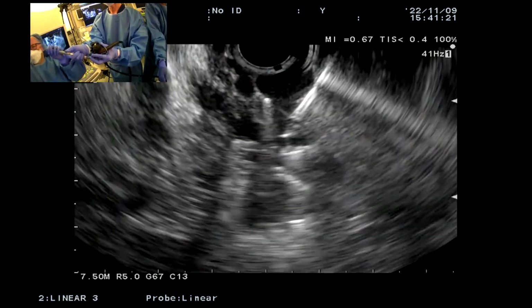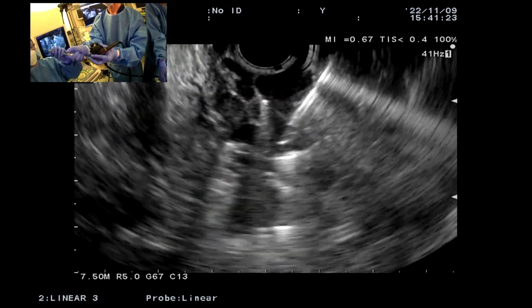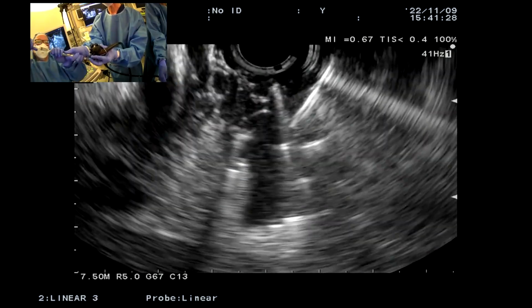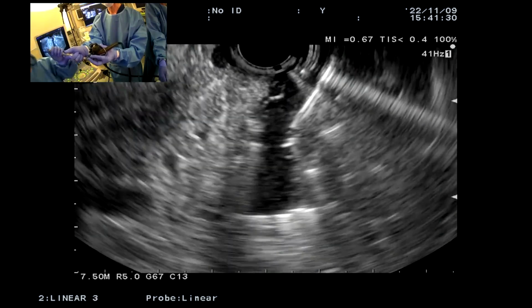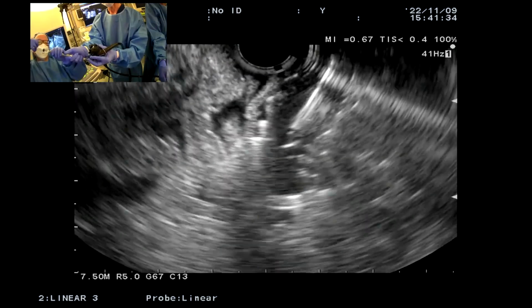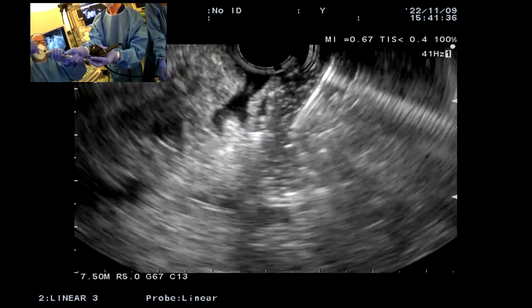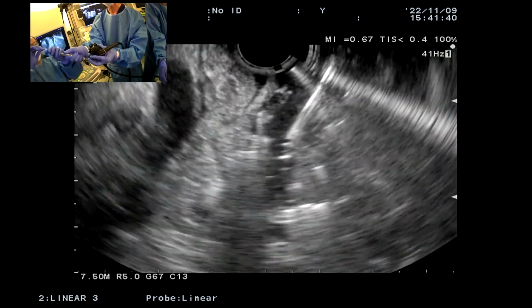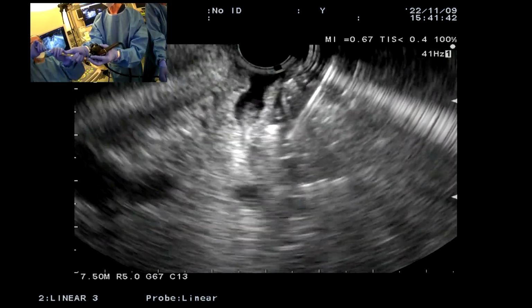One moment. We have nice artifact from the coils. And when we inject the glue, it's really slow. So we're dripping it down. We got blood return again. The nurse confirmed that. And flushing again. So you see there's much less, look at that, the bubbles are not as vigorously moving. Do you want both? Okay, glue's in good. Yeah, both glues, everything.